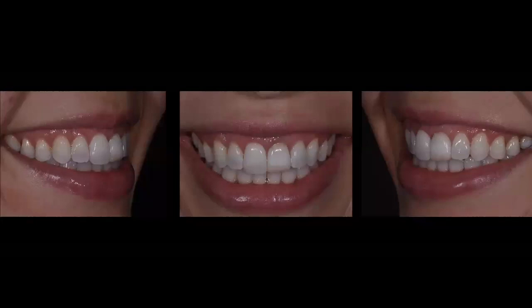When you look at these small photos and you look at the lip, how high her upper lip moves and displays this pink aesthetics, this high smile line, you can see that if for whatever reason the tooth was ankylosed at the moment of extraction and implant placement, how easy would it have been for any periodontist, oral surgeon, implantologist or restorative dentist to reproduce exactly what she has, and maintain that gingival zenith for tooth number 9 exactly where it is.